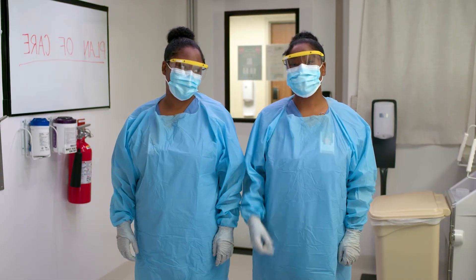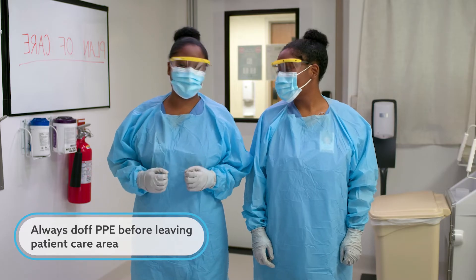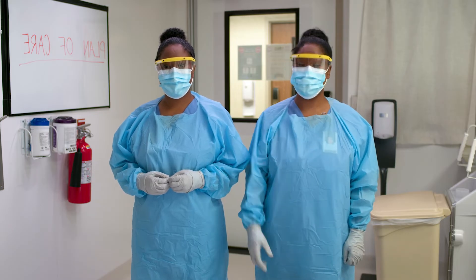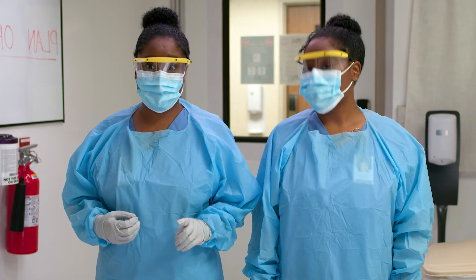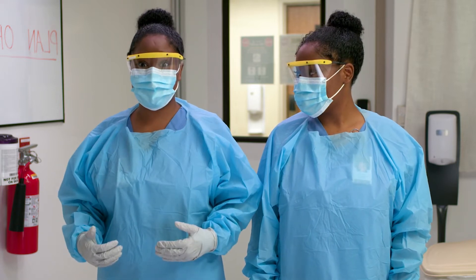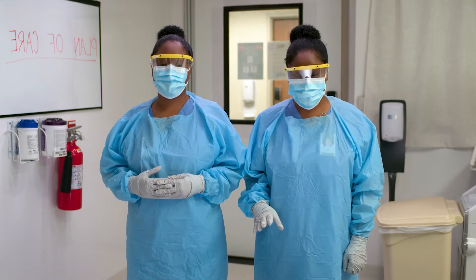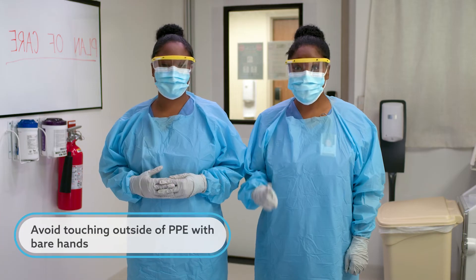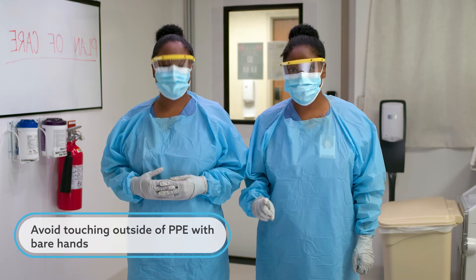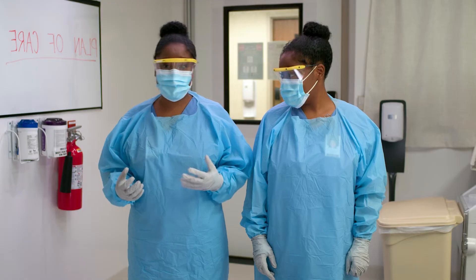Now it's my turn. Let's doff! Always remove PPE before leaving the patient care area. However, if you're wearing a respirator, remove it after you leave the patient care area. Remember, this is very important: the outside of the gloves, eye protection, mask, as well as the front of the gown are contaminated. This can make doffing a little tricky. To minimize chances of contamination, don't touch the outside of the PPE items with ungloved hands while removing your PPE. If you accidentally touch the contaminated area, perform hand hygiene immediately.